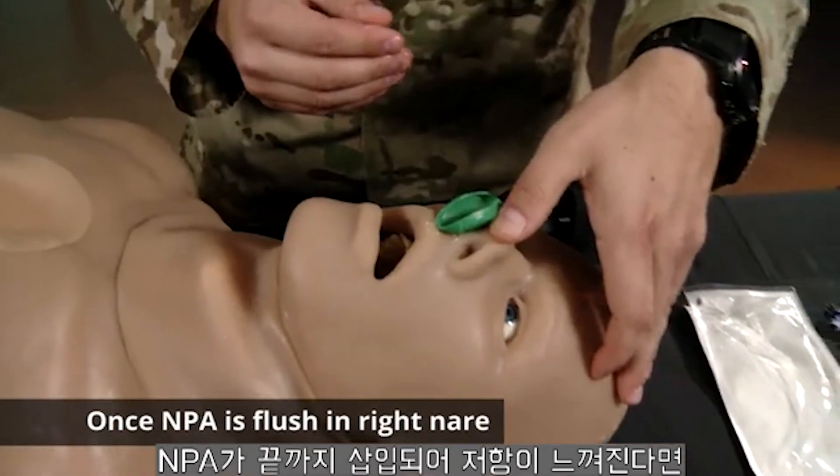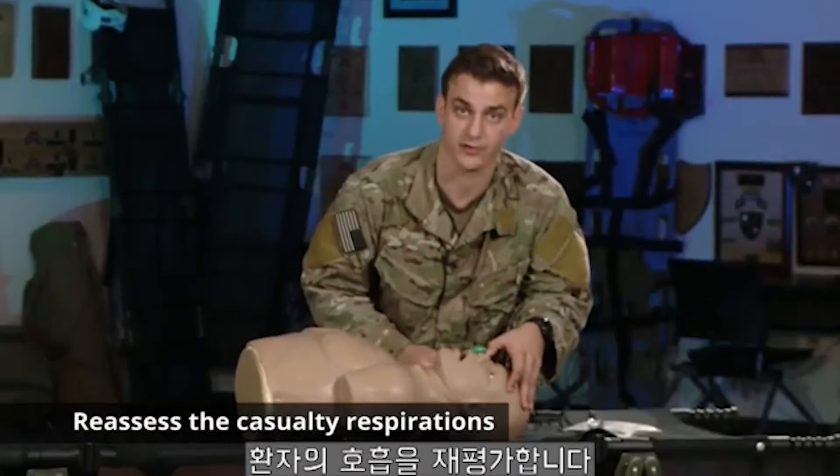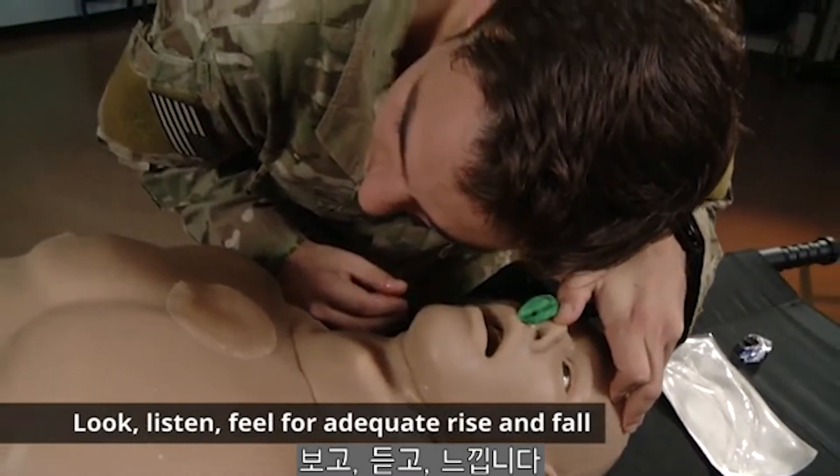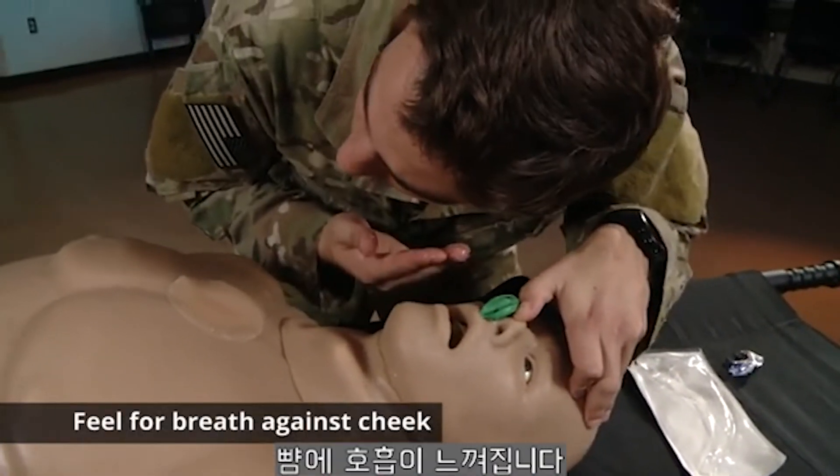Once the NPA is flush in the right nare of the casualty, you're going to want to reassess your casualty's respirations. I'm looking, listening, and feeling — looking for adequate rise and fall and breath against my cheek.